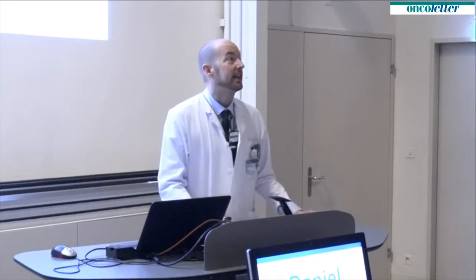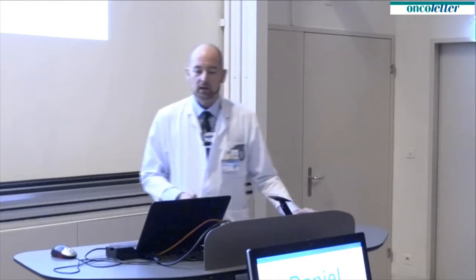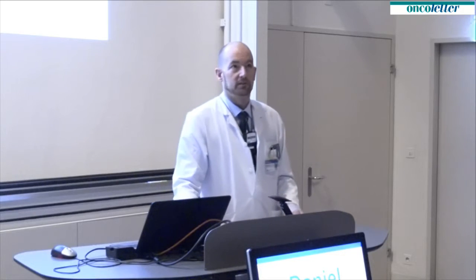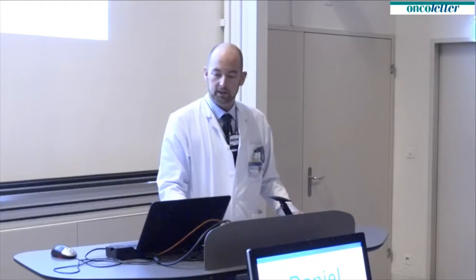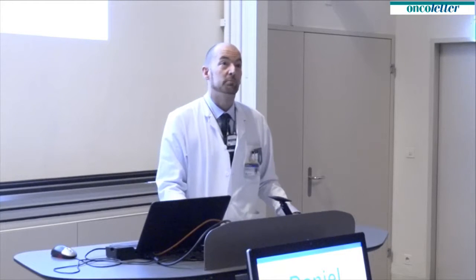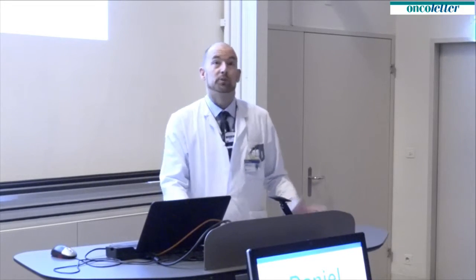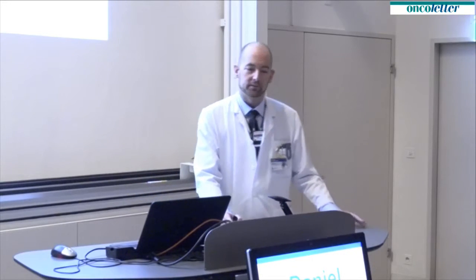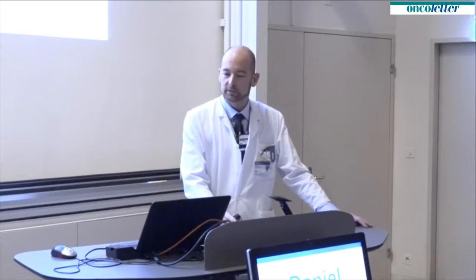So the current indications for bronchoscopic treatment of lung cancer are mainly against the bronchoscopically visible tumor, also of central lung cancer. The principles are, I think, older than me, and I'm proud to have learned these techniques from Lutz Freitag, who is the current head of the interventional department here.